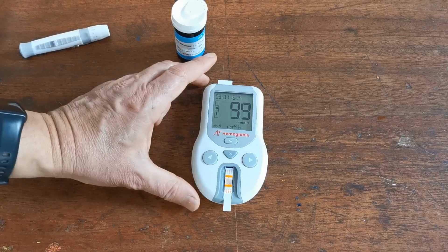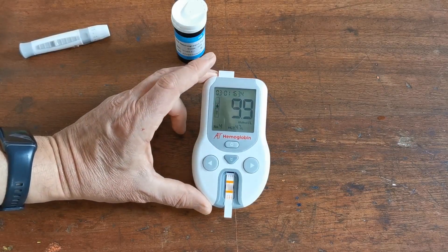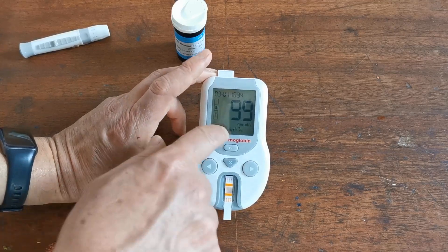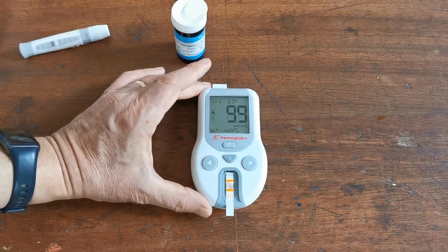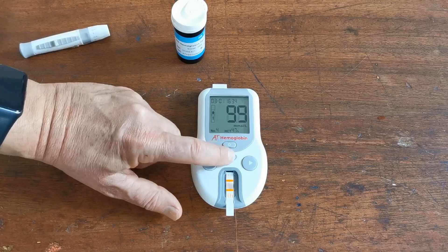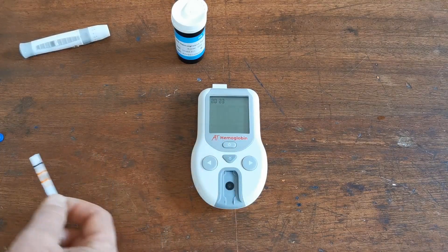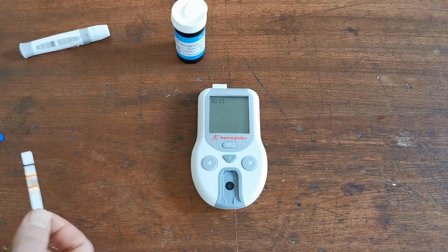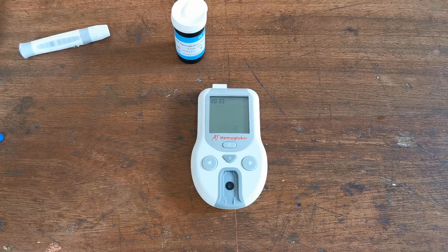I've got my reading in millimoles per litre: haemoglobin 9.9, and the haematocrit showing along the base is 47%. When you've performed the test, you can eject the test strip using the ejection button, and the test strip can be removed and disposed of. That memory will be retained in the meter. And that is how you perform a haemoglobin test strip test using the AllTest Haemoglobin Meter.